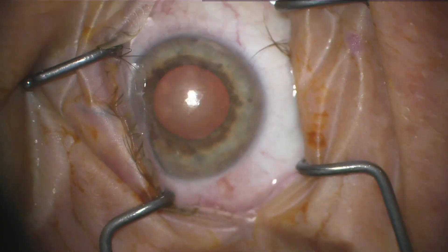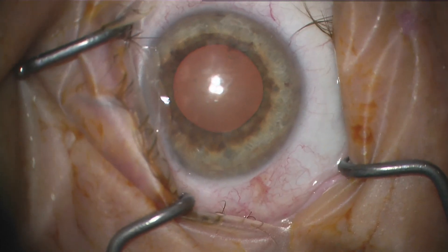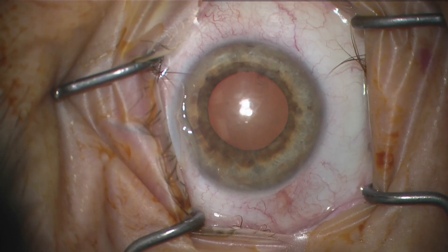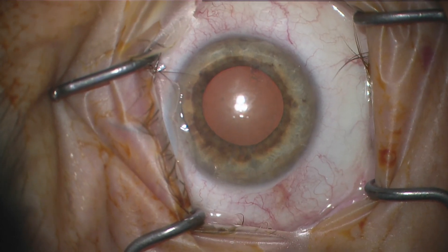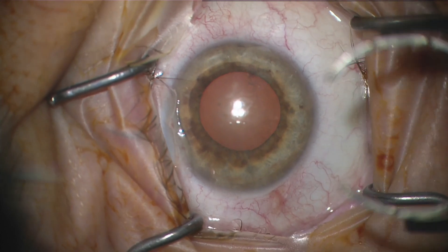Hi, this is Austin Nakatsuka and this is going to be a pretty quick video demonstrating the use of the MyCore 700. It's not really phaco, sorry — it is a cataract extraction device, and essentially our location was one of the first places in the United States to be using this.